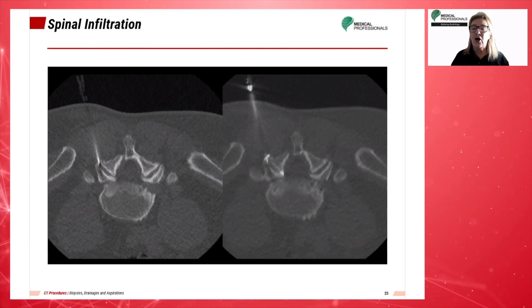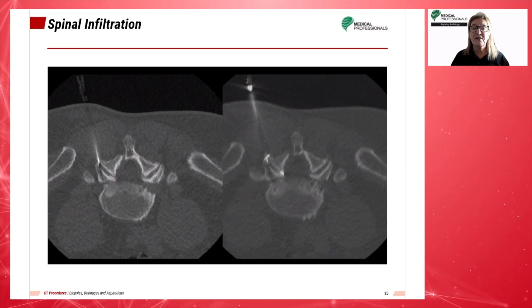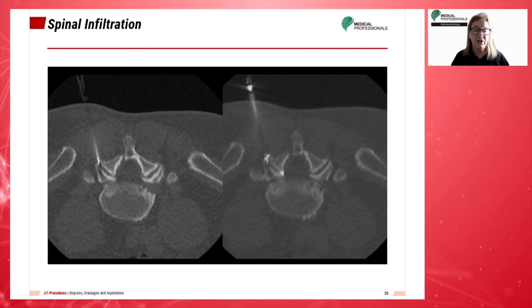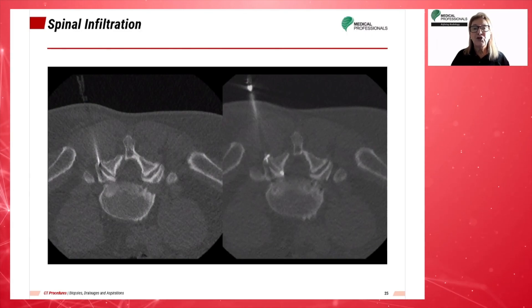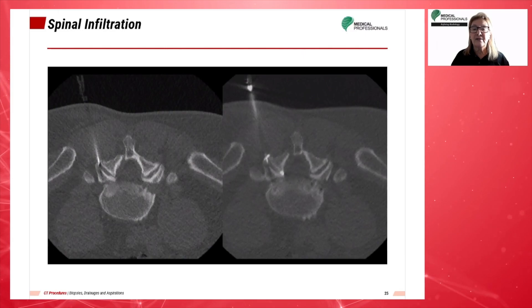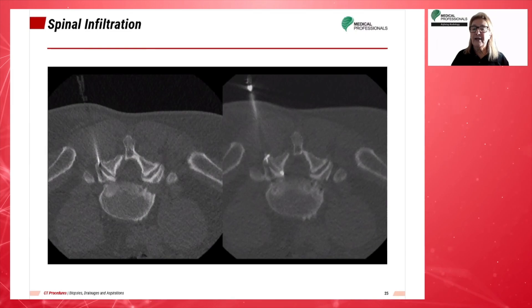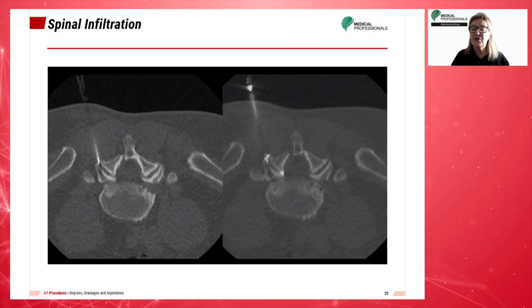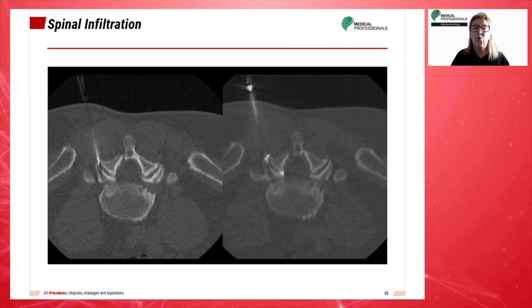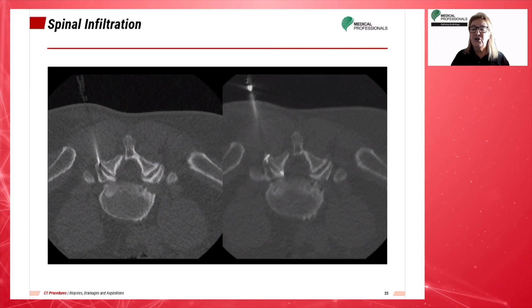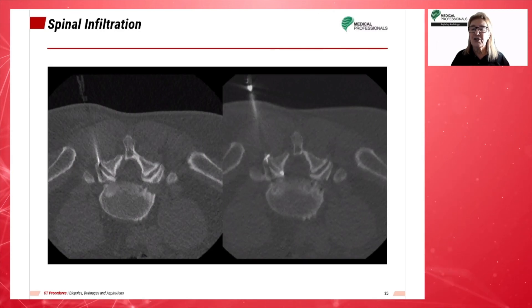This can be a major cause of lower back pain, which affects the patient's mobility, physical function, and quality of life. Using CT guidance, infiltration is the injection of local anesthetics, steroids, or ozone into the lower back for the treatment of sciatic pain due to disc herniation or facet joint syndrome, as seen in these images.